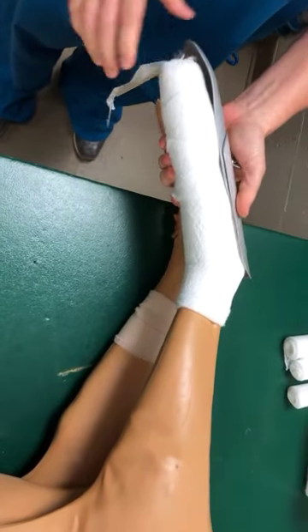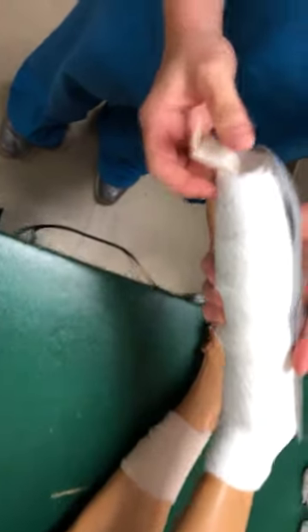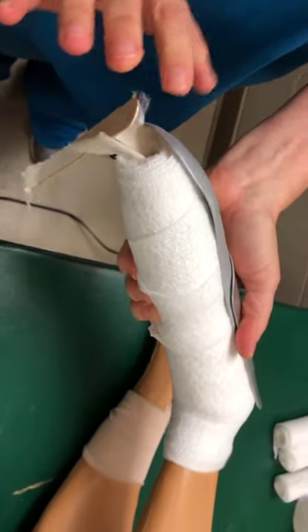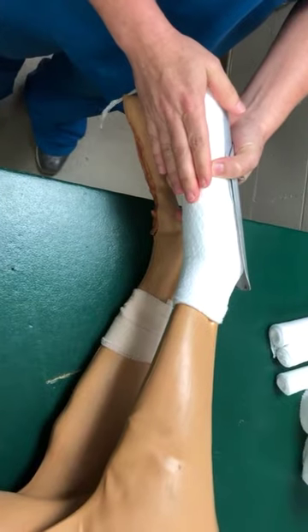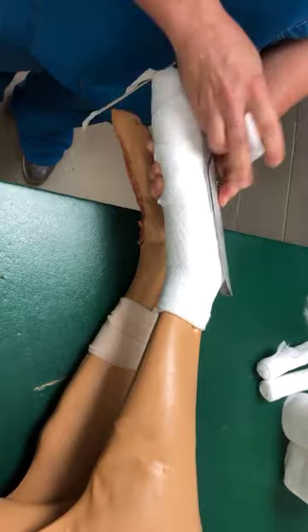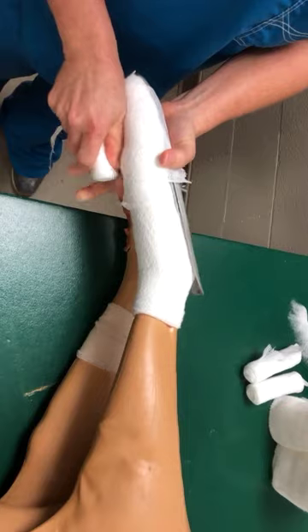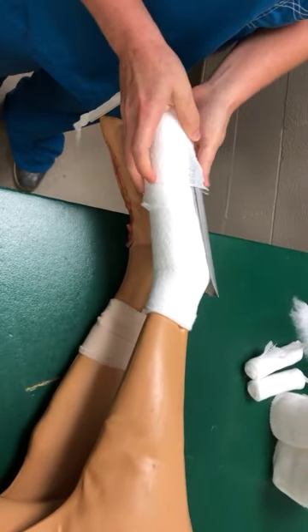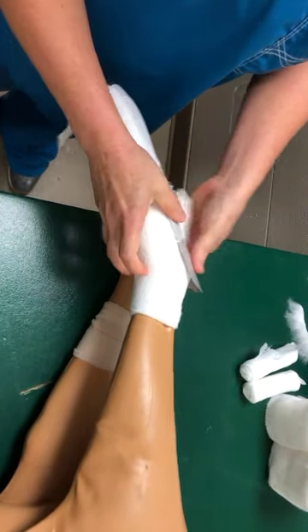We will take our splint. Remember we have our metatarsal fracture — notice here I have the toes with the splint, so when the patient bears weight, the patient is going to bear weight on the splint. It also goes above the tarsus, which is very important on these to make our patient more comfortable. We're going to use our stretch gauze to hold the splint in place, applying with the same amount of tension as over the cast padding, so we'll give it a good tug.